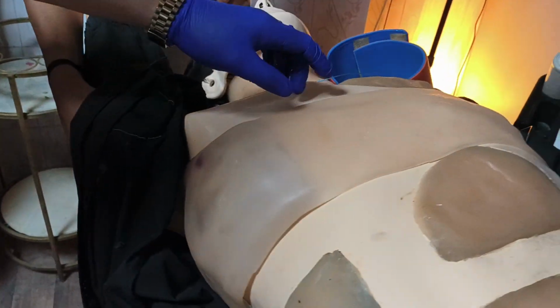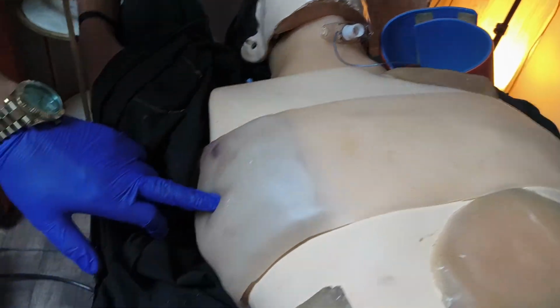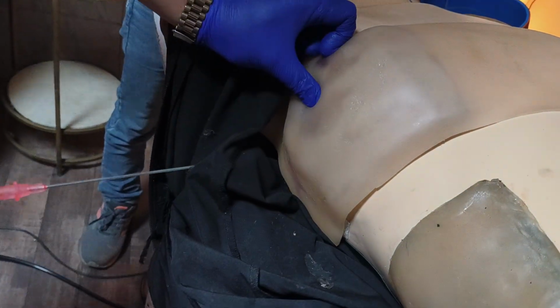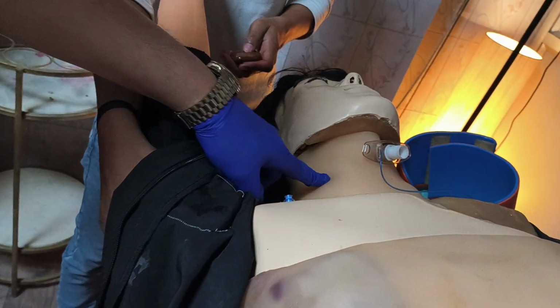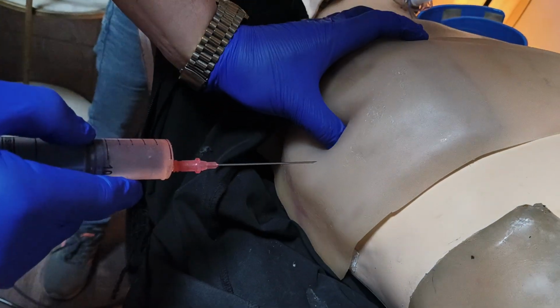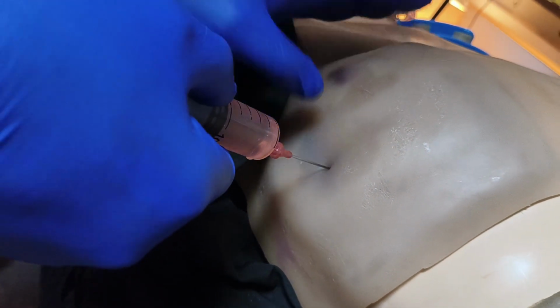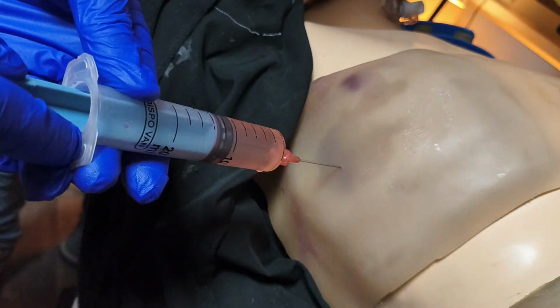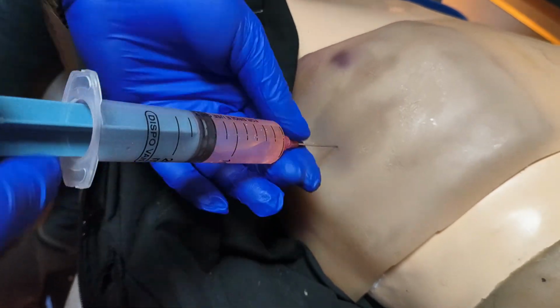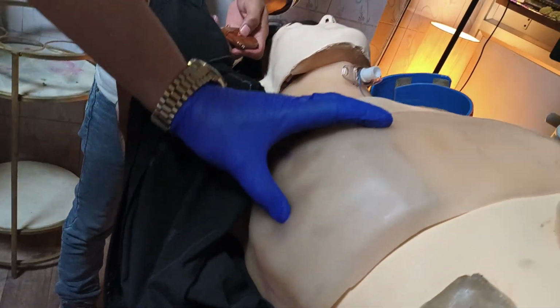So you can see the left side is rising. There is a chest rise on the left side, but on the right side there is no rise. So distended vein. So we will go for needle decompression. Upper border of the lower rib. You get a feeling, and there's air. Okay. So now we can put the ICD also.